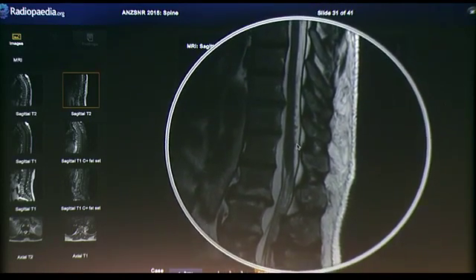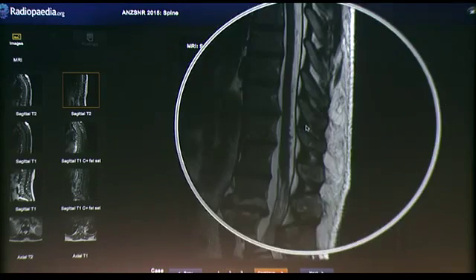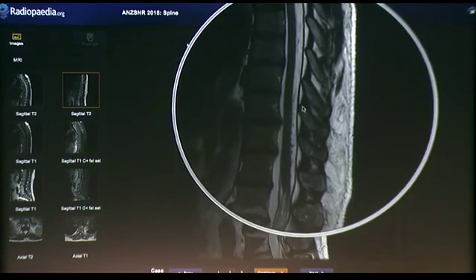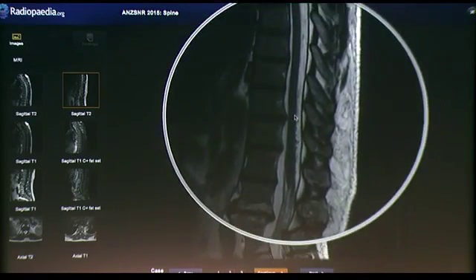Now, we had a beautiful case earlier shown to us from Ranil Chandra of possibly the largest fistula I've ever seen, with really extensive cord signal abnormality. And they're not that hard to pick when you've got gross flow voids all over the entire spine. These ones are also important, though, to keep an eye out for. Because this is definitely more than you'd expect.